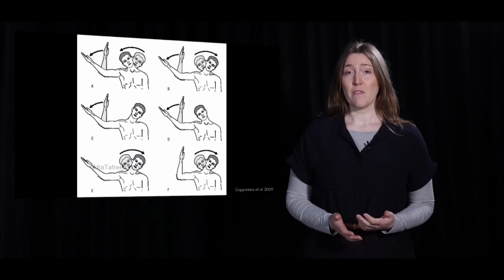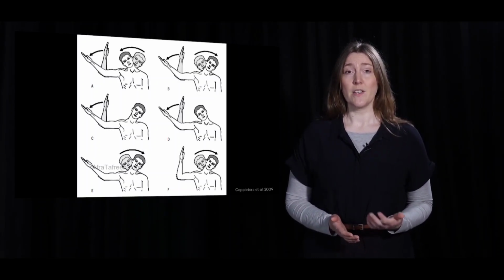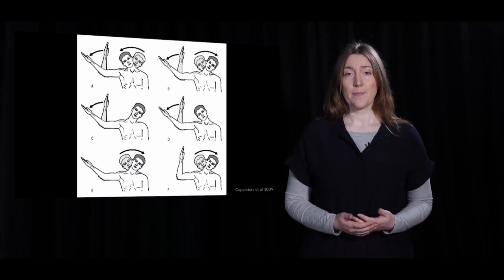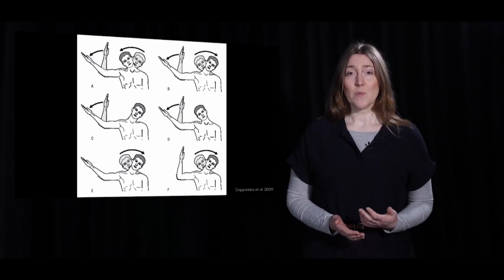The experienced sonographer can also visualize the neurodynamics of peripheral nerves when the patient does nerve mobilization techniques like sliding and tensioning. Research has shown that neurodynamics can be assessed with ultrasound.